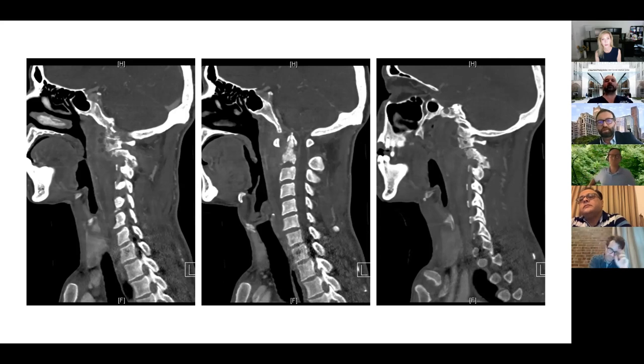So I'm interested in your opinion before you show us what happened to the patient, because I have a feeling I know what happened. But let's say you were involved at this point. Would you have done anything differently besides what they did? Absolutely. The ADI is pretty concerning. There's a subluxation ventrally. This is an unstable situation. I wouldn't be liberal in mobilizing a patient with a Miami J collar. There's a lot of evidence of instability, at least at C1, C2.